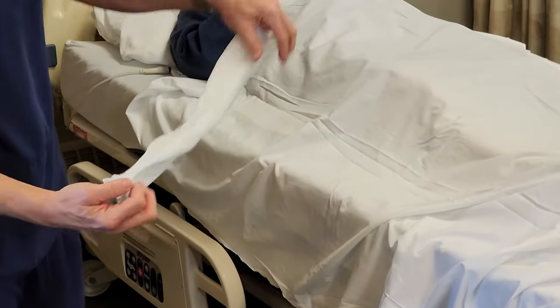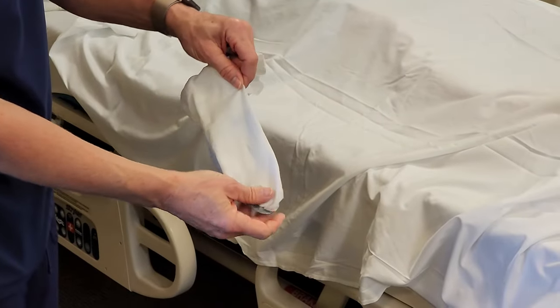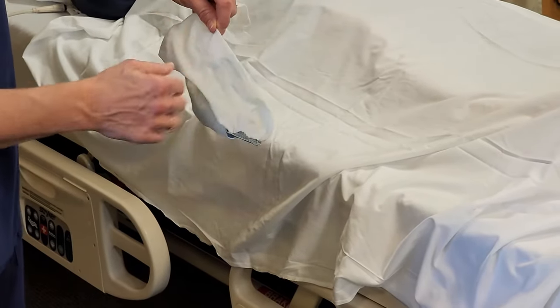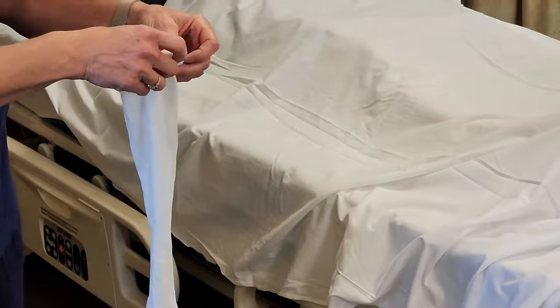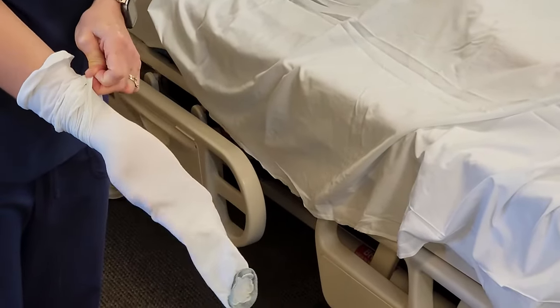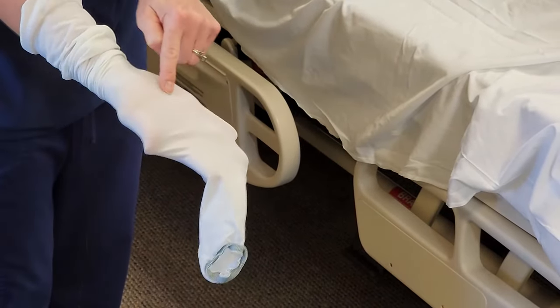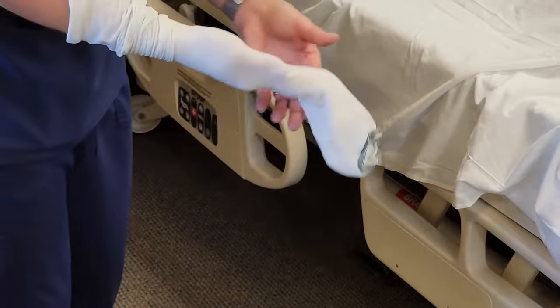When you have the Ted hose, if there's writing on it, it should be on the outside — you should be able to read it correctly, so it shouldn't be backwards once it's on the resident. You also want to locate the heel marker, so put your hand in like you're going to put it on their leg, stretch it, and you can see the square that's going to go on the back of their heel.